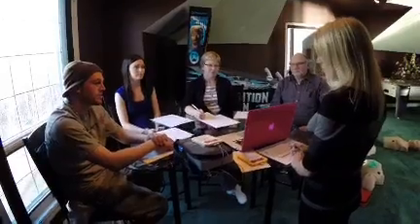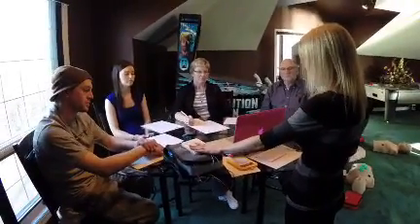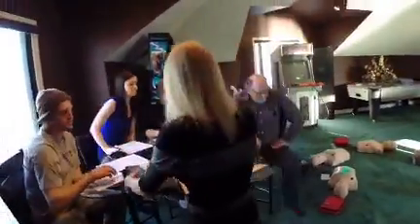And what about patch medication? Some people have heart conditions and have nitroglycerin patches. Do you think we can use this on somebody that has one of them? I would say yes. Yes. The thing you have to do with that is you have to be careful you don't touch that medicine. So you want to make sure you have your gloves on, peel the patch off, and then take the cloth, there will be a cloth in your bag, wipe all the medicine off before attaching your pads. Okay? So now let's go down to the floor and we will try using our AED.